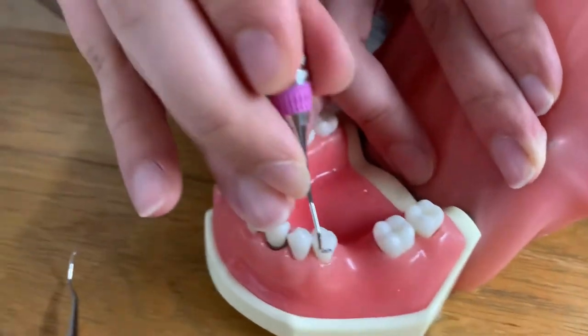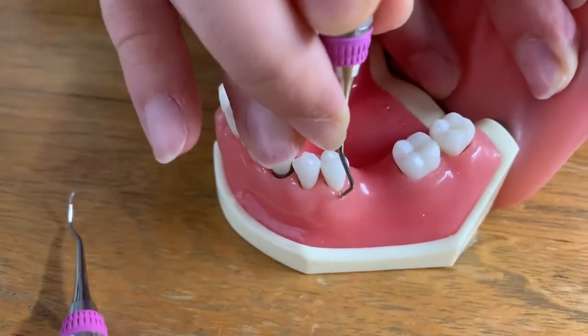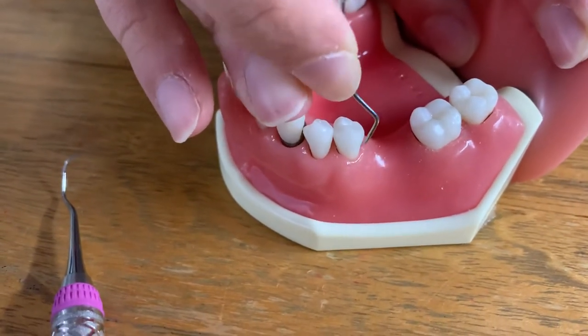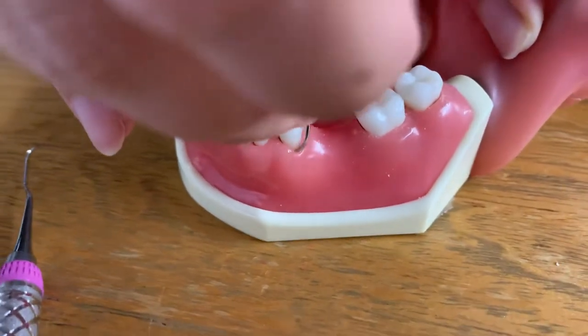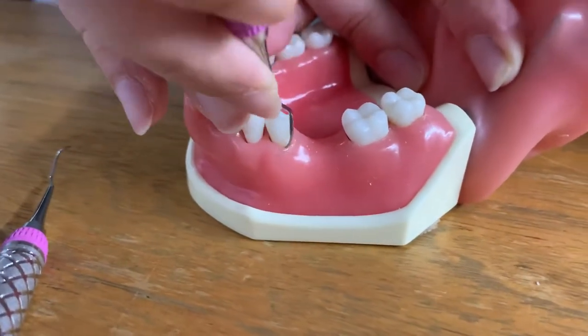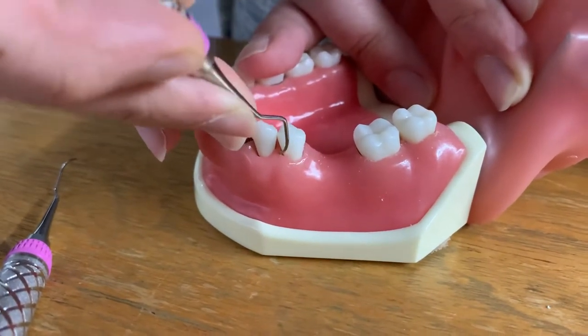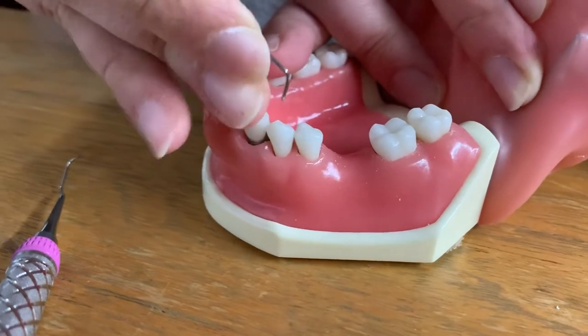Now we can do it right over here for this premolar tooth. I'm going to insert, open, activate. Same thing — start back at the distal line angle, make sure we hit every part: insert, open, and activate. Just like that. Perfect.